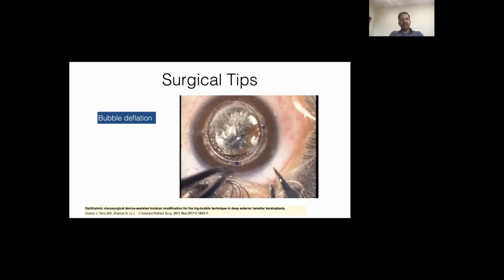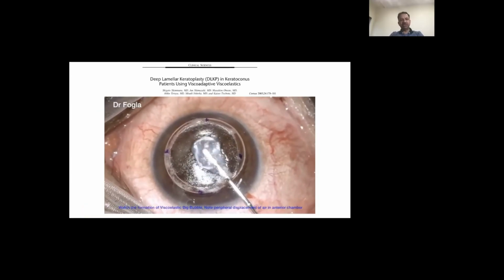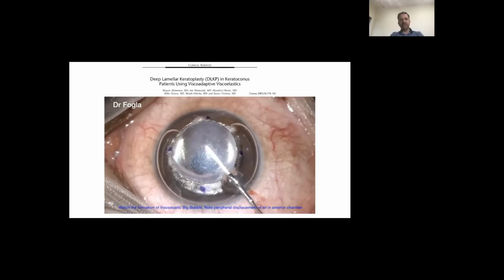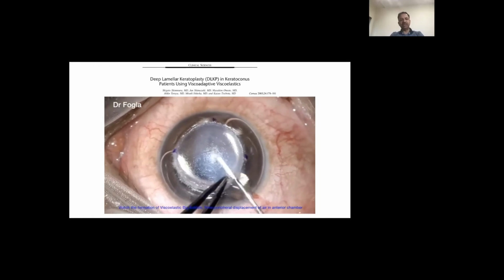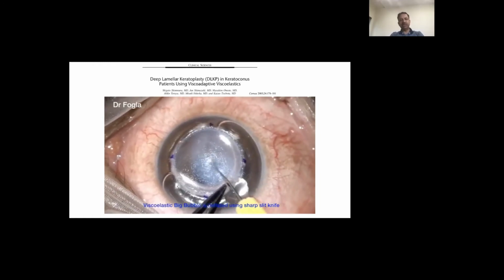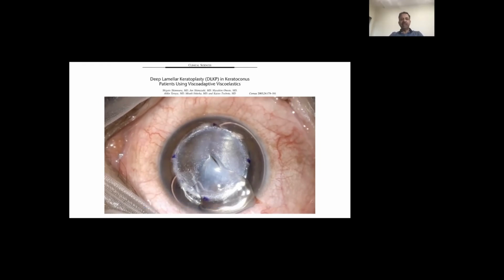Instead of using air, you can use cohesive viscoelastic as well to create what is called a viscobubble. Here you have to have a softer eye before you inject the viscoelastic. As the viscoelastic is more dense, it requires a greater amount of pressure. So you place an air bubble also into the eye, so you can use the reflex against the air bubble to decide how deep your cannula is, as described by Mellis. And once you get the viscobubble, the rest of the steps are pretty much similar.